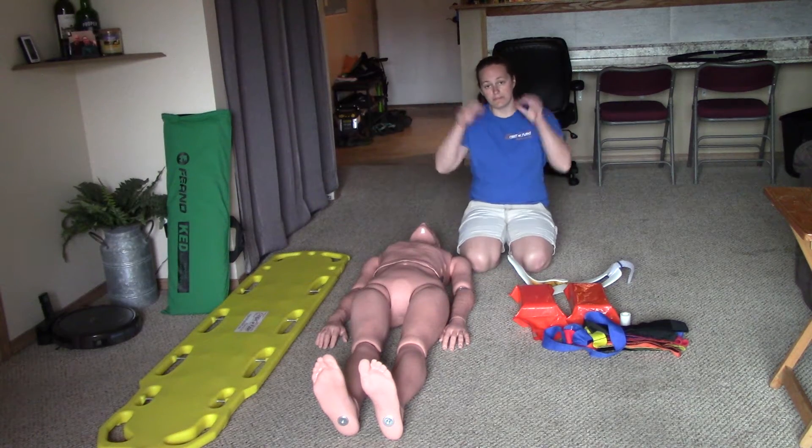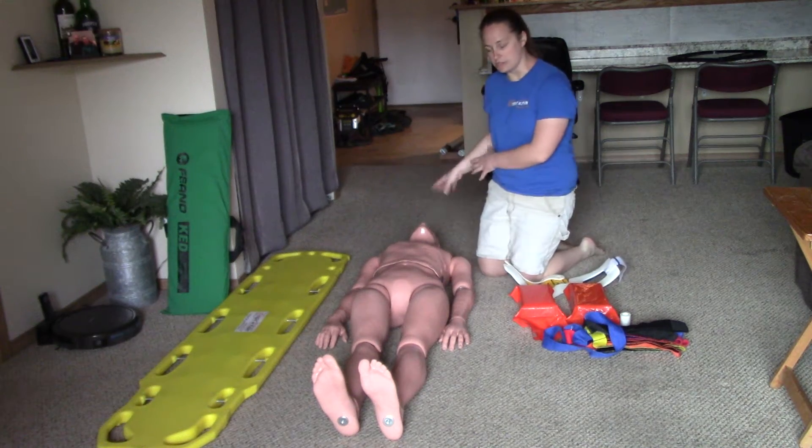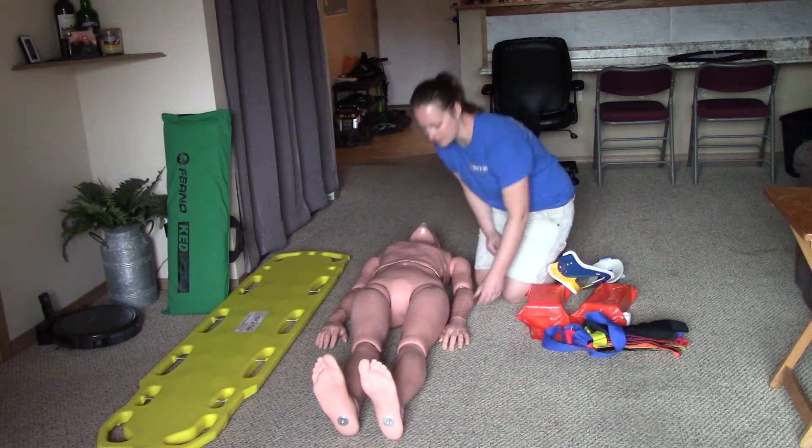I'm going to start with PPE. For bonus points: my scene is safe. I'm going to have my partner hold C-spine — please hold the head in a neutral inline position. For bonus points, all I really have to say is C-spine.